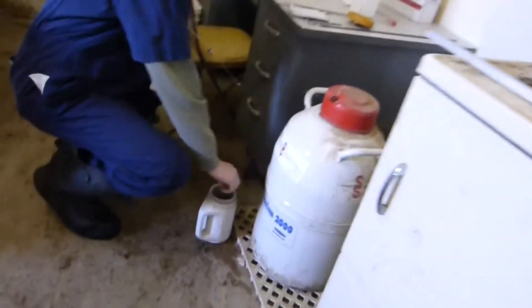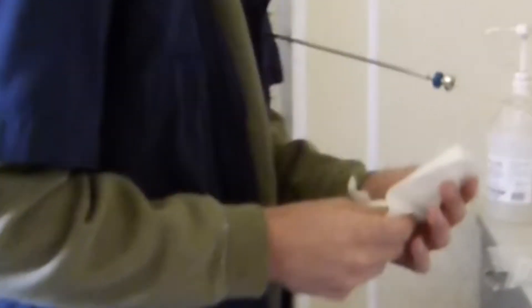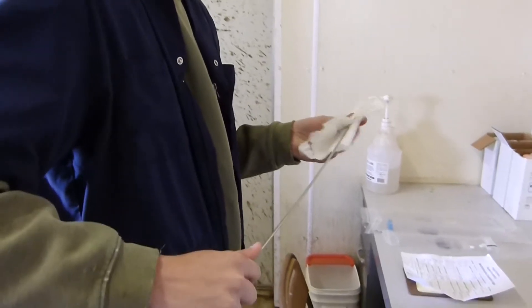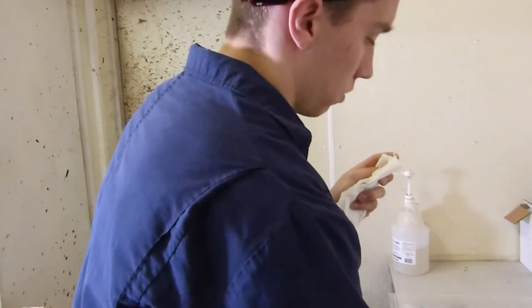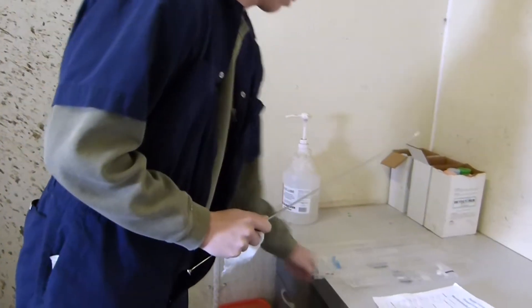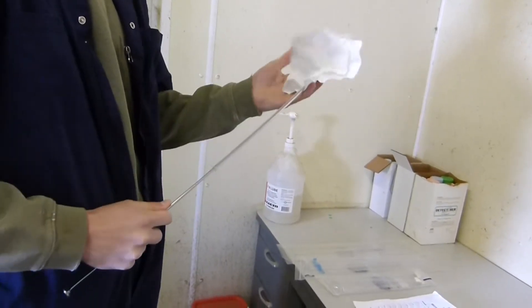I dry off the semen straw and place it in the tip of the gun that I have just prepped. I then trim off the end of the straw and place a plastic sheath over top of it to keep the semen straw in the gun. On top of that sheath I then put a paper towel around that to also protect it against germs and airborne things.